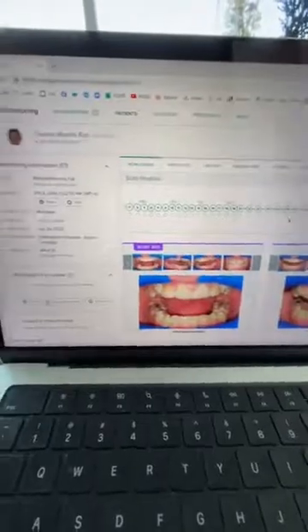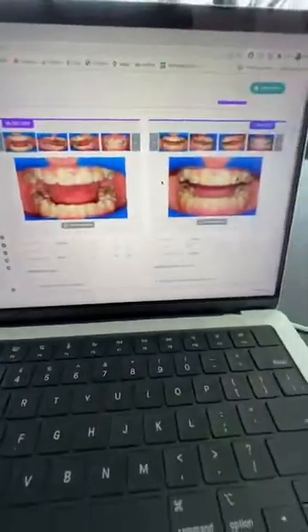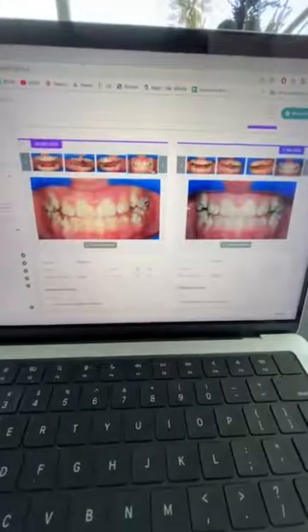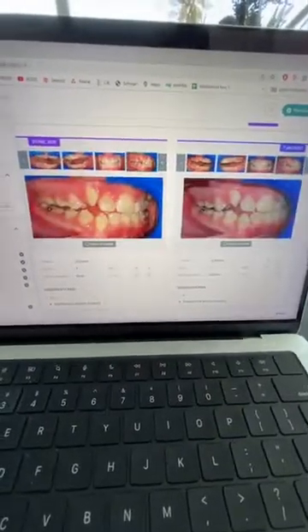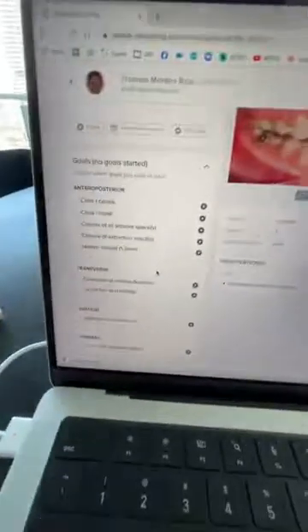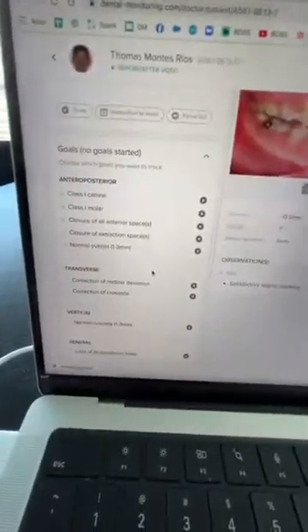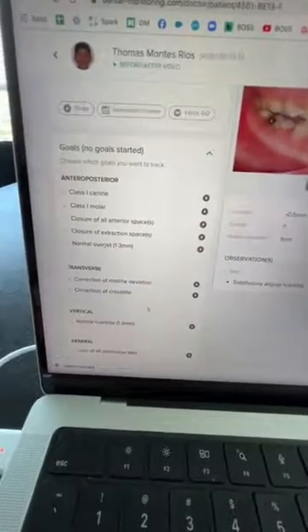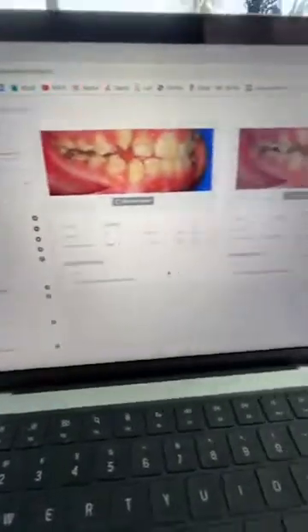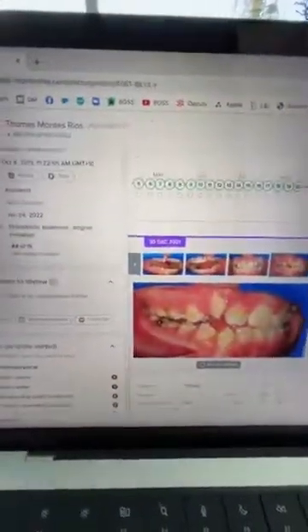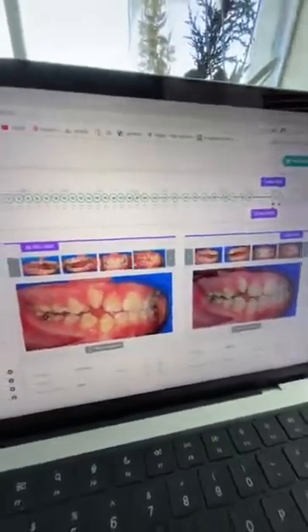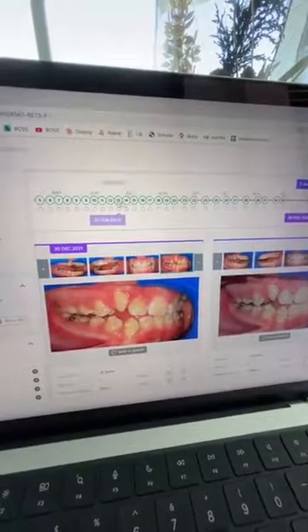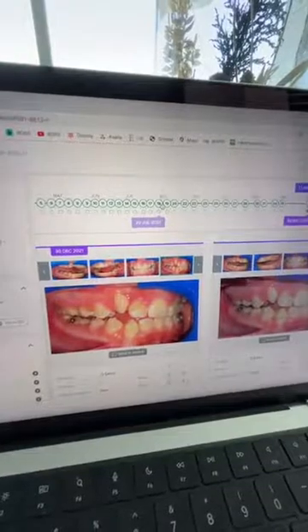For example, I'll bring up a patient who's in treatment. You can actually see how their treatment is progressing. You can see views with and without aligners, their bite, how the treatment's going. You've got a lot of things you're tracking like their canine-molar relationship, their midline, their overjets, overbites, and you can set up a lot of alerts for your patients.